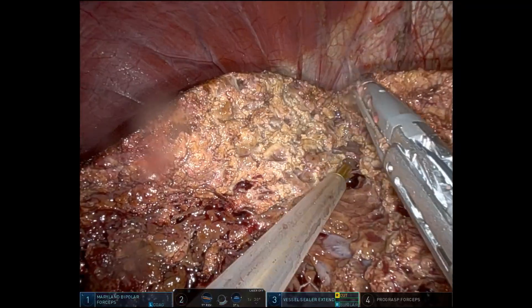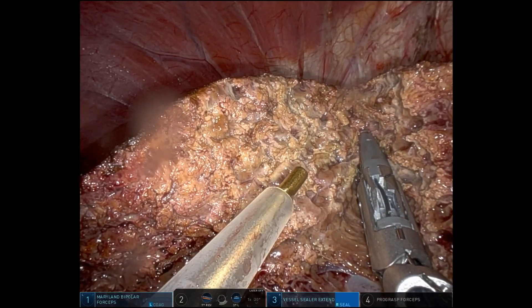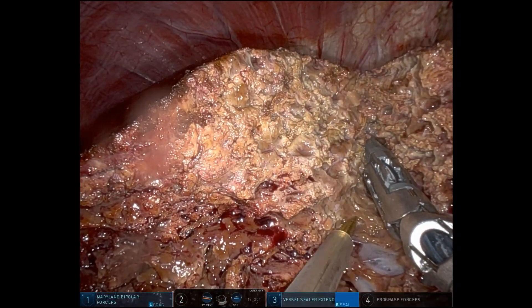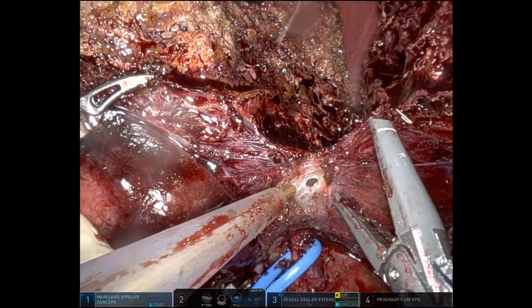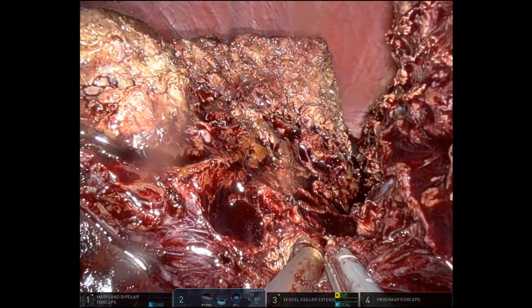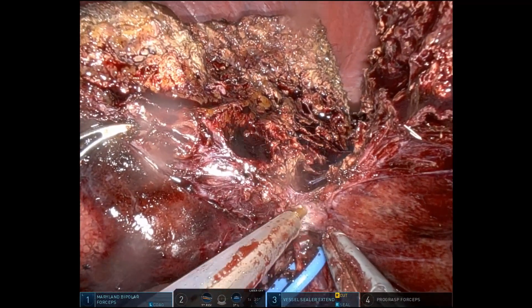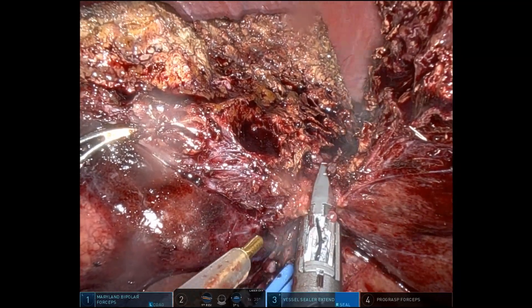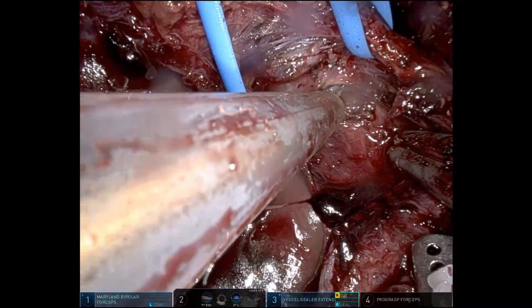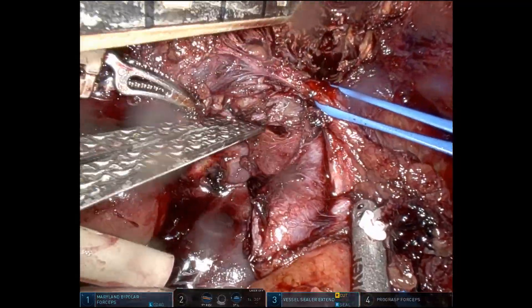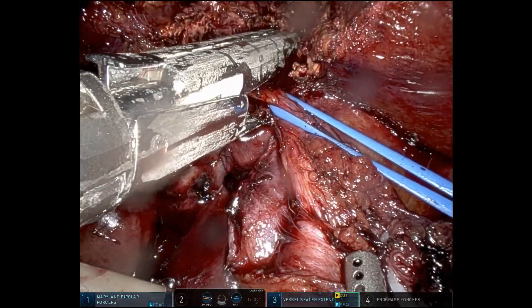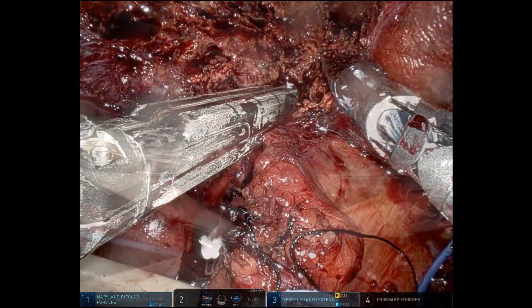You can see the middle vein in the bottom right of the screen. So we're working cephalad towards the dome of the liver. We're going to divide the right hepatic vein as essentially the last step of the procedure. Here we are returning to the hilum of the liver — we had not divided the hilar bile duct yet. We prefer to divide this intra-hepatically so that we can keep the left hepatic duct as far away from the transection as possible, so that we don't narrow the left hepatic duct when performing a right hepatectomy.